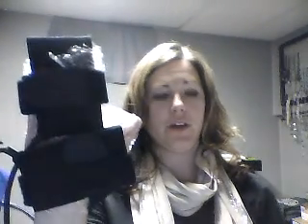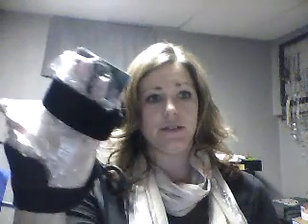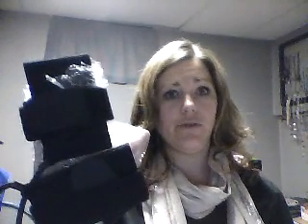The pads, you want to cover as much of the area as possible. Excuse me, and reach for my other pad here. So typically, whether it's the hand or the foot, you will want this placed in more of a T-shaped pattern. So you can see here, I have it in a T-shaped pattern. And it's also a safety precaution that this is not applied to the tops of the hands, tops of the feet. So this would stay on for about 40-45 minutes.